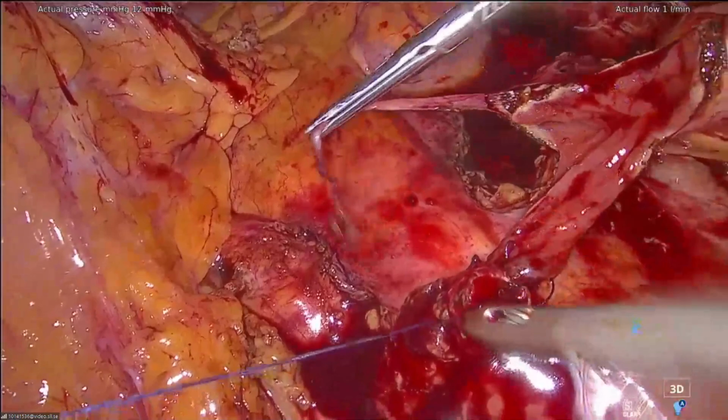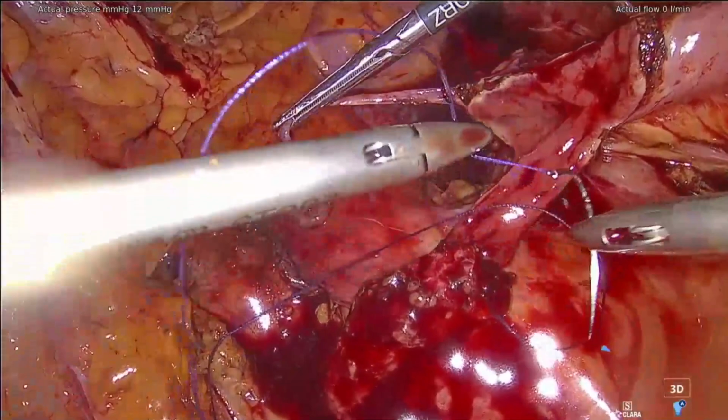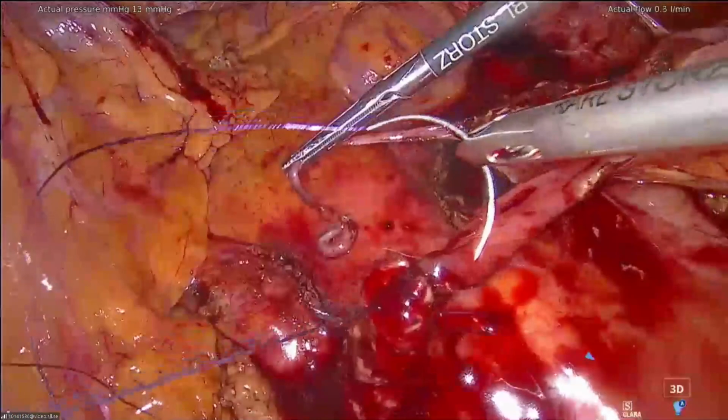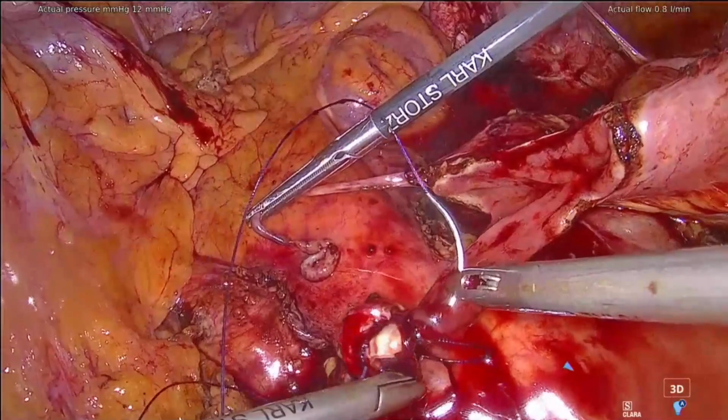It's something coming from the past that we had to do separate stitches to avoid stenosis, because it's ischemic. But I think it was just the rain dance. We do the rain dance, and when the rain comes, we believe it's because of the rain dance. With laparoscopy and robotics, we know it's completely false, because many sutures performed in the past with separate stitches are now done with running suture and nothing happened.